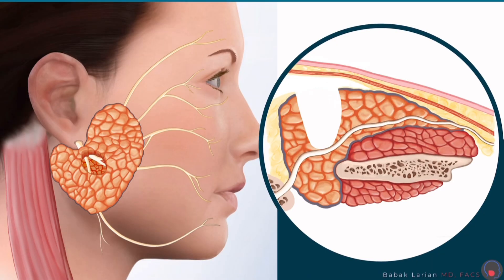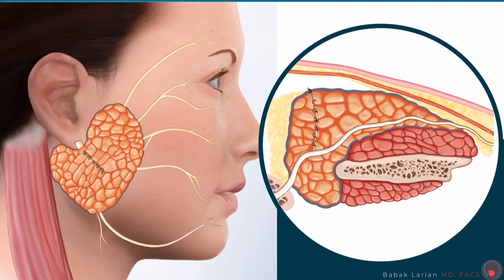If I can bring the two edges of the parotid together — because parotid tissue is similar to breast tissue, very pliable and easy to work with — then that's what I prefer to do, and that's what you're going to see here. I bring the two edges together and suture them, and then I can lay the skin down on it.